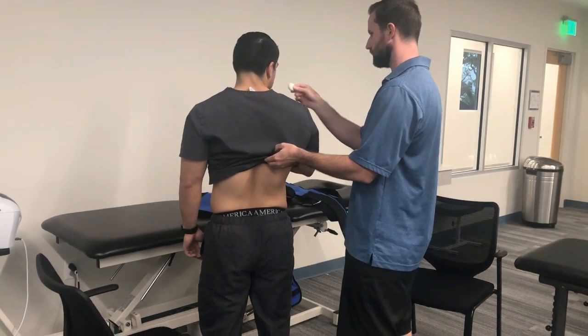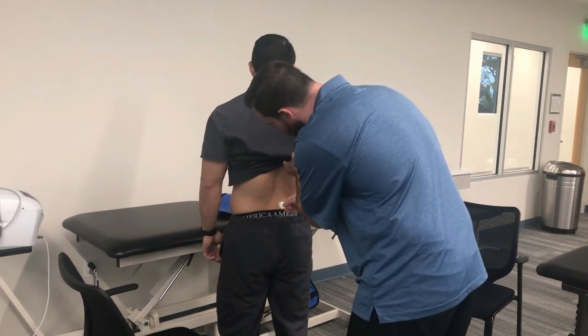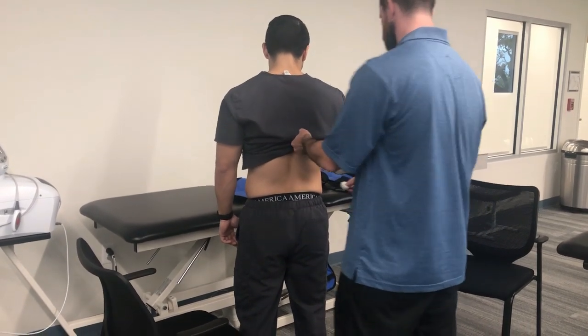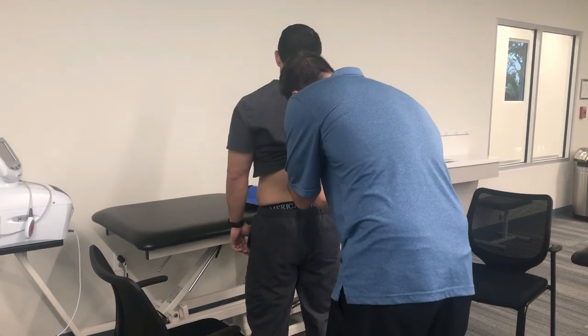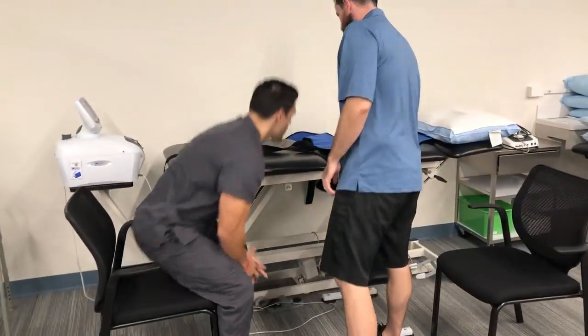So I'm going to take this and touch your cheek with it. So that's what it's going to feel like. And then I'm going to do your lumbar area. Anytime you feel the cotton swab, I want you to say yes. Yes. Yes. Yes. Yes. Yes. All right, great. Go ahead and lay down up here for me.